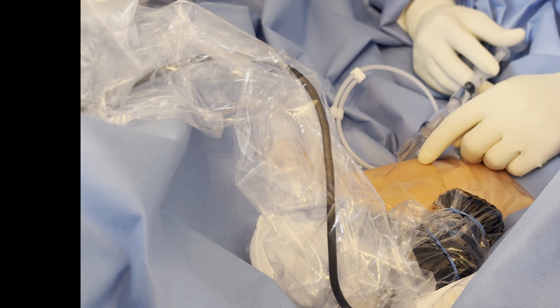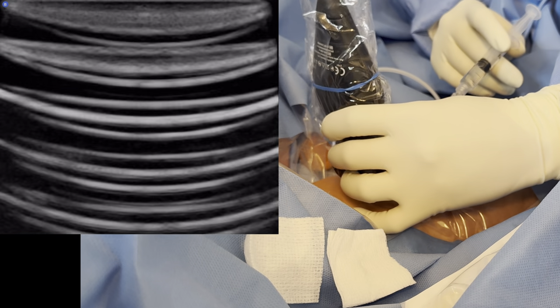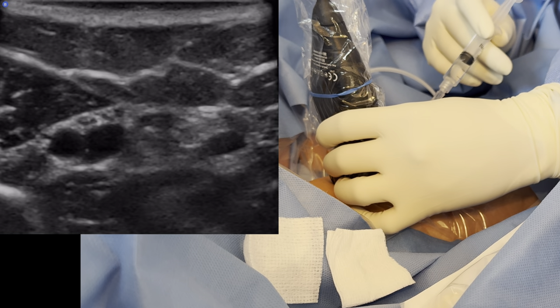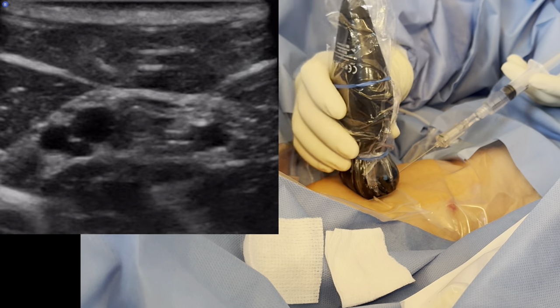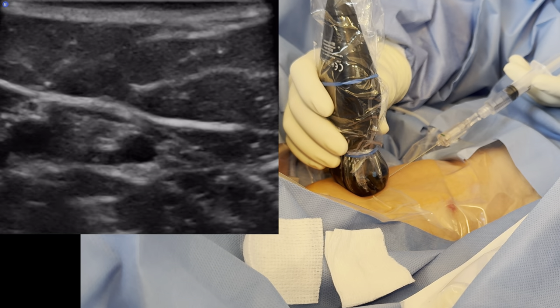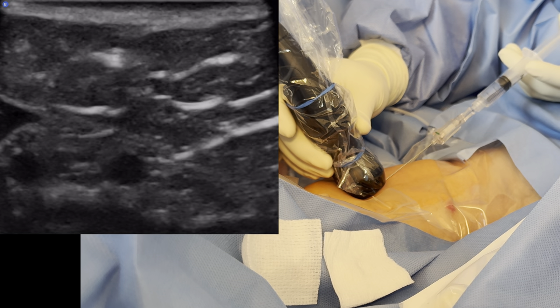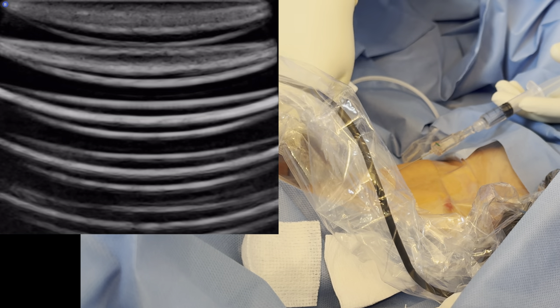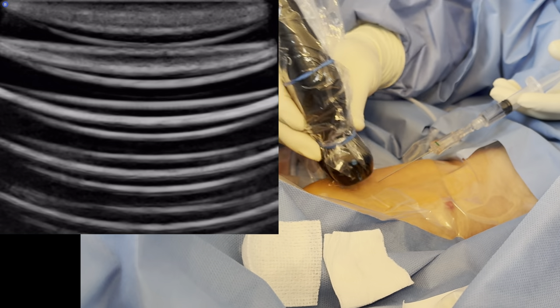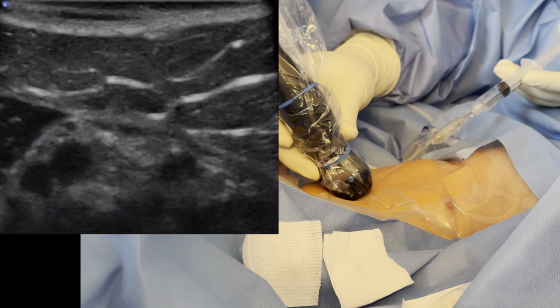A little pain there? So I'm going to let that lidocaine take a little more time to work, because when that dilator goes in I need to make sure she doesn't feel much. I like to put a generous amount — that skin needs to raise. You should see even pockets of the dermal layers opening up. If you do not see that skin raising, you're too deep and the lidocaine is ineffective. You've got to make sure you see that wheal, or else you just injected a useless amount of lidocaine unnecessarily into the subcutaneous tissue with little to no efficacy. Can you feel this pinch? What about now? No pain.